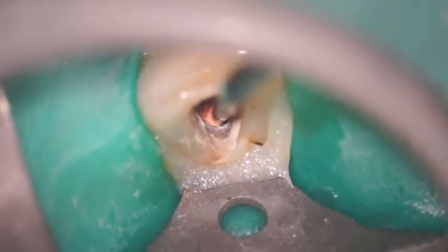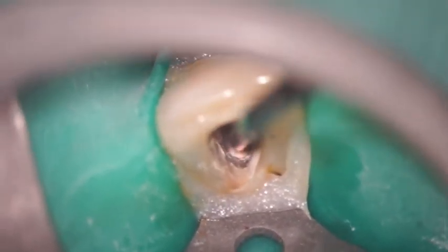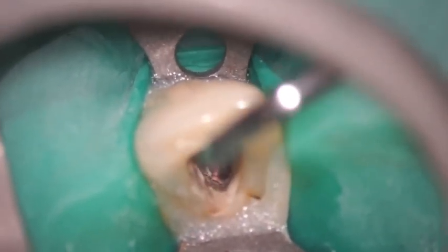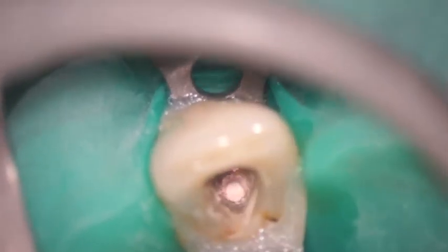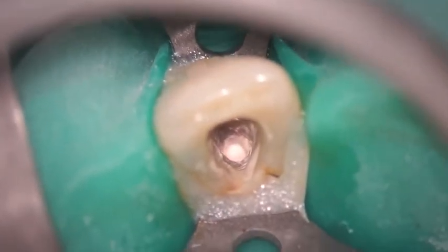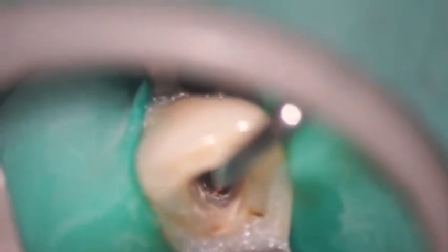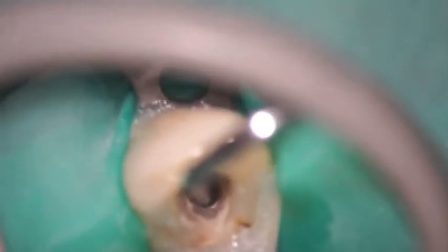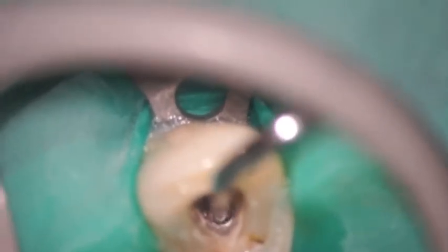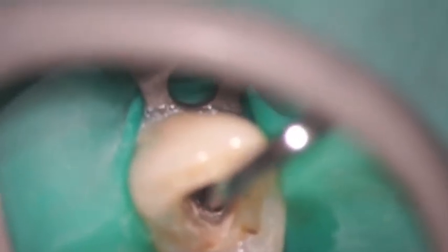Now we're going to take the Calamus heat plugger tip and drive it down into the root canal system, condensing it vertically and also creating tremendous hydraulic pressure, then immediately following it up with another Calamus plugger — a hand plugger — that allows us to again condense that warm gutta percha apically and vertically, capturing the maximum amount of three-dimensional anatomy in the root canal system. Now we're removing with the Calamus heat tip another aliquot of gutta percha, then going to a smaller Calamus plugger and condensing that gutta percha again vertically, capturing the maximum amount of lateral and tertiary anatomy in the root canal system.